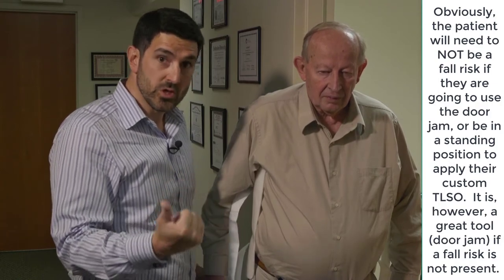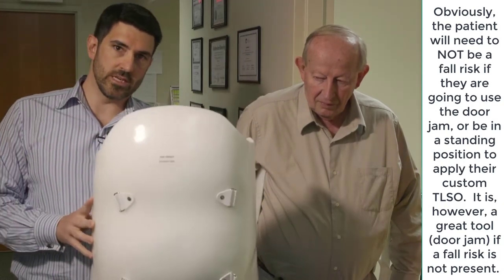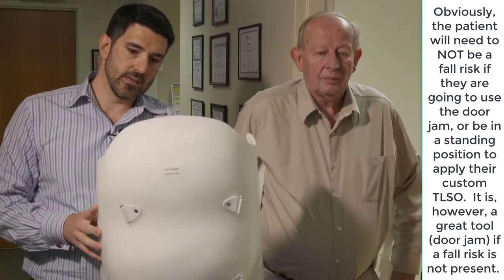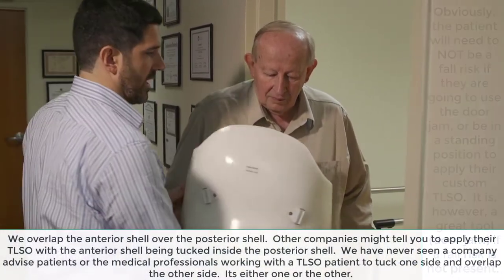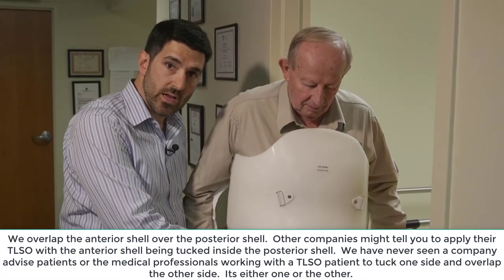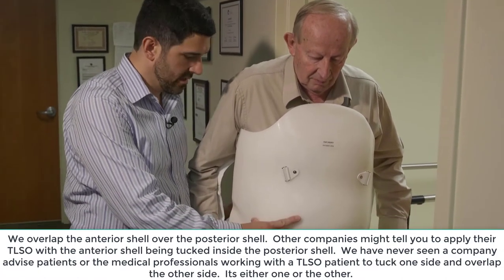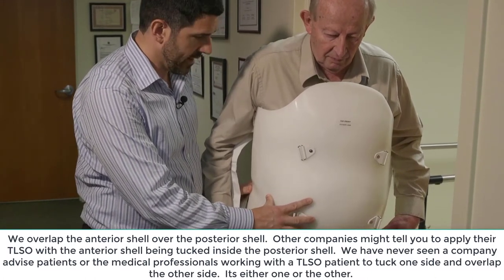I'm going to grab the anterior portion of the brace — here's the anterior shell. The way we do this is that it goes on over the top of the back piece. And we try to line up the waist grooves when we do that.